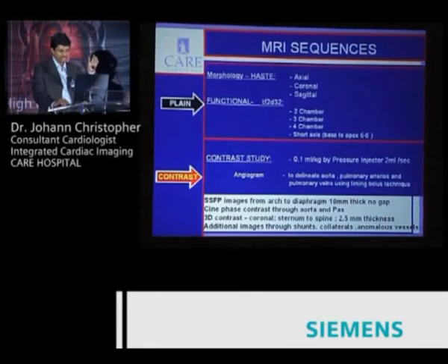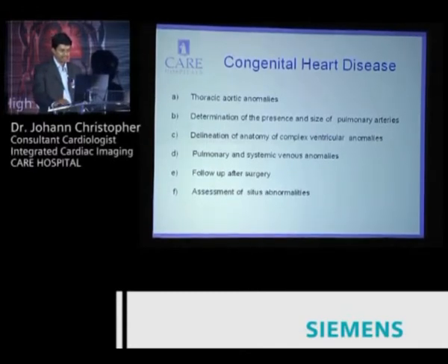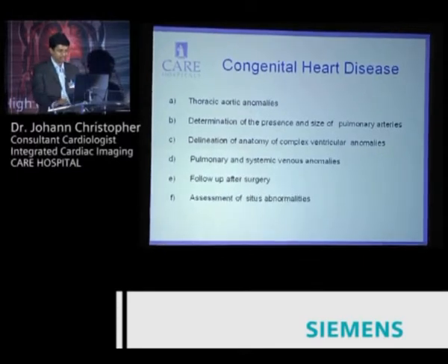We used to look at the significance of stenosis across the coarct, but now what we're doing, and this is something that has been validated also, is that we sample a coarct just below the stenosis, and we do another sampling distally just above the diaphragm, and we're able to find that if the coarct is severe, the severity of coarct on echo correlates with a marked increase in the flow distally just above the diaphragm. We are just going to publish that.